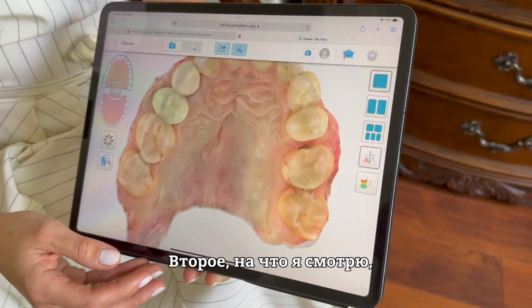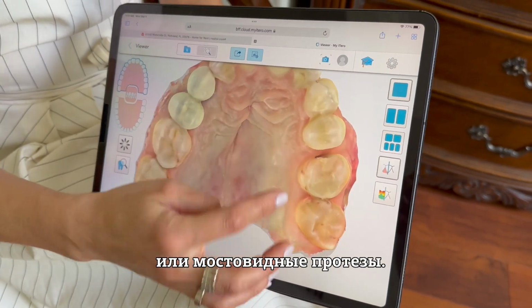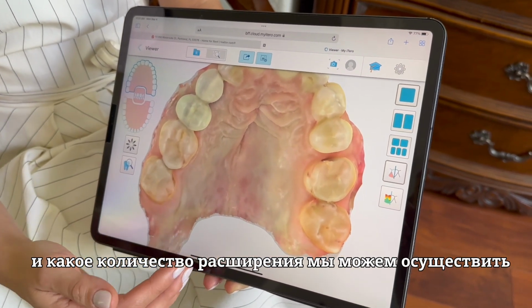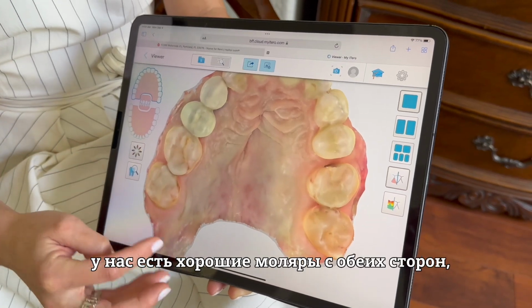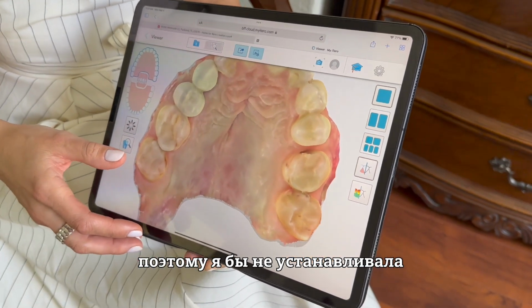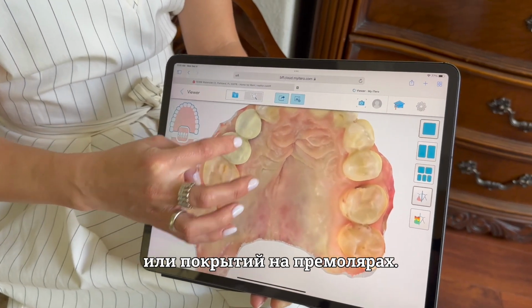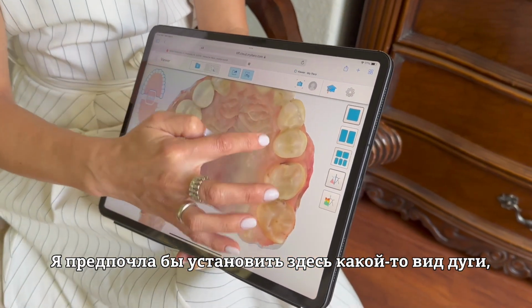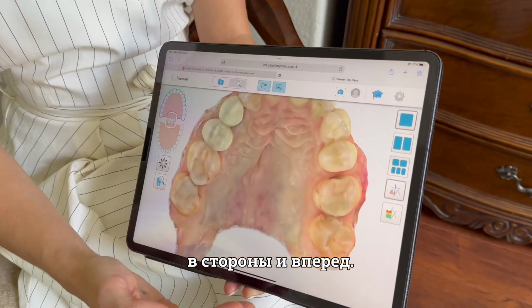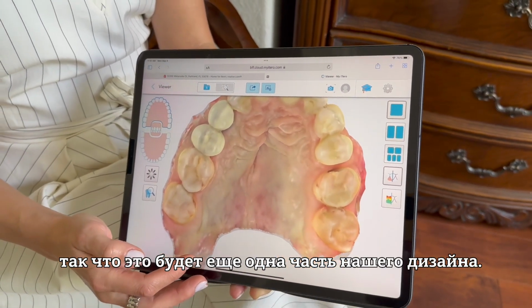The second thing I'm looking at is these anchorage teeth. Are there any crowns? Are there any bridges? Is there enough support to carry the appliance? And what is the amount of expansion we can do? For example, we have good molars on both sides. We have some crown work right here, so I would not place any type of bands or any type of covering on the premolars. I would rather put a type of arm right here because I still want to have expansion going to the sides and going forward, I mean mesial to the back molars. So that's going to be another part of our design.